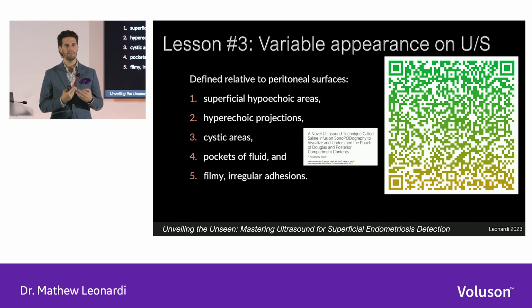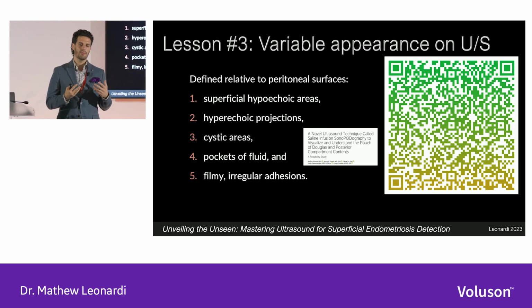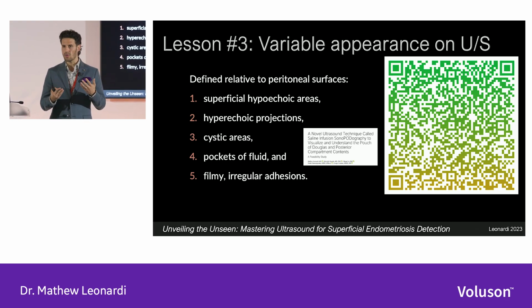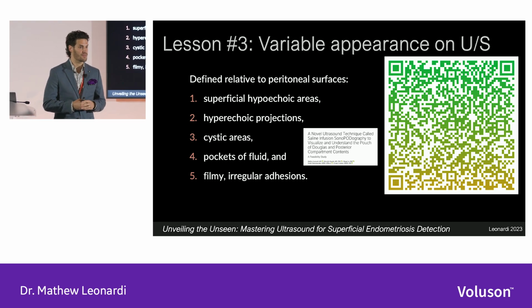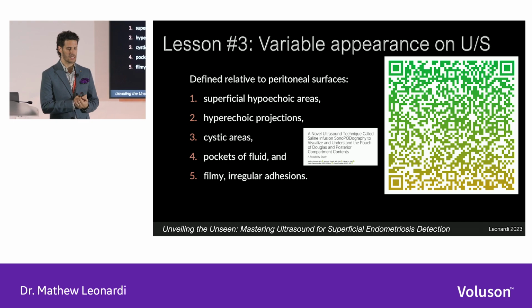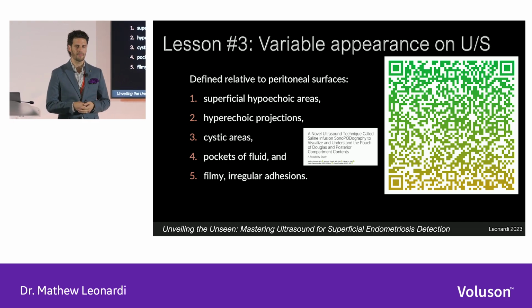This was a technical paper on performing saline infusion sonopodography, pod being pouch of Douglas. And I know around the world we call this space different things. Some call it cul-de-sac, some call it rectuterine pouch, but in Australia it's pouch of Douglas, so saline infusion sonopodography.